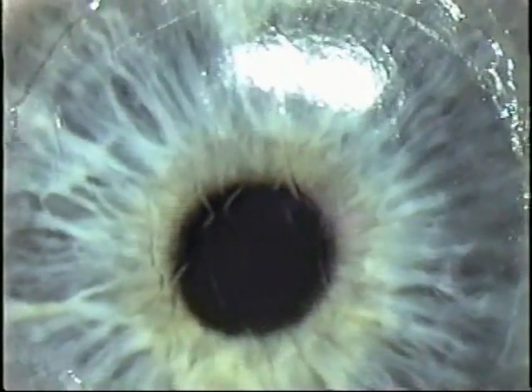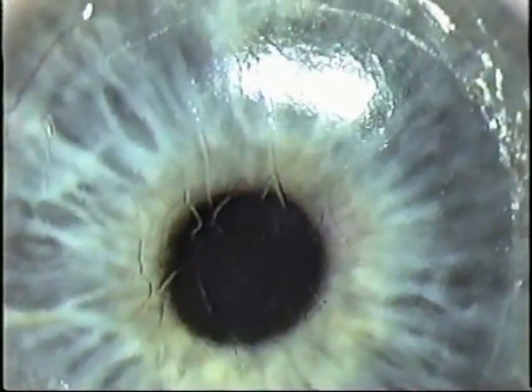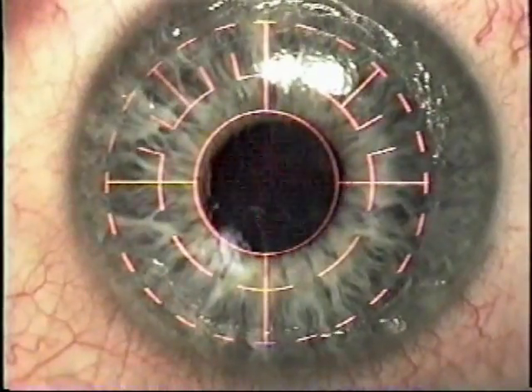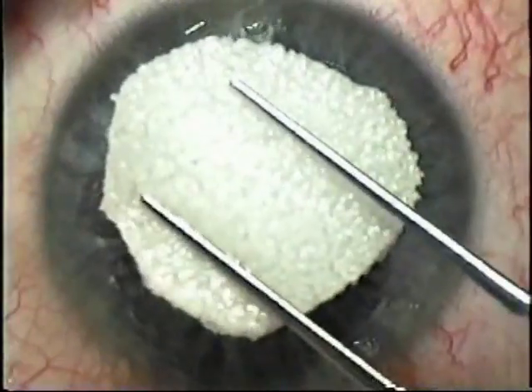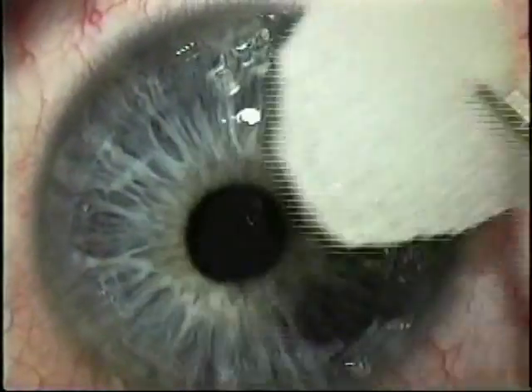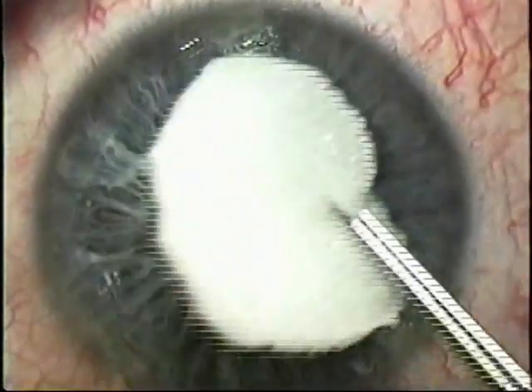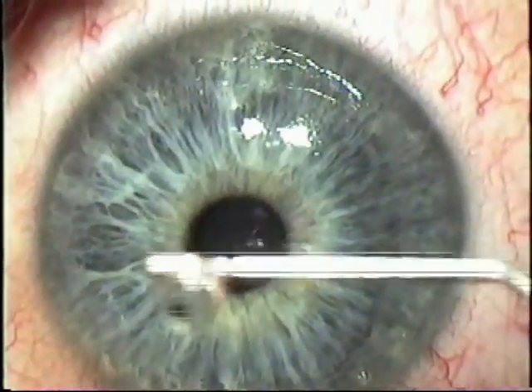In cases of superficial previous LASIK flap abnormalities like flap wrinkles, a myopic laser profile can be used for flattening along with mitomycin C for excellent visual and refractive outcomes.